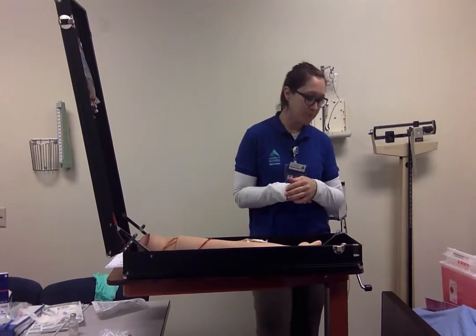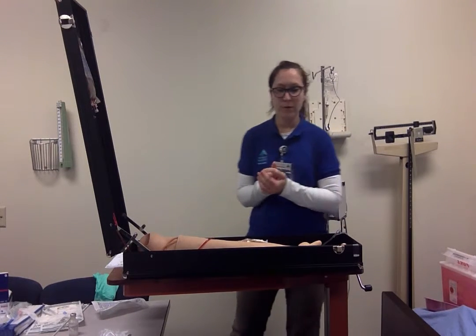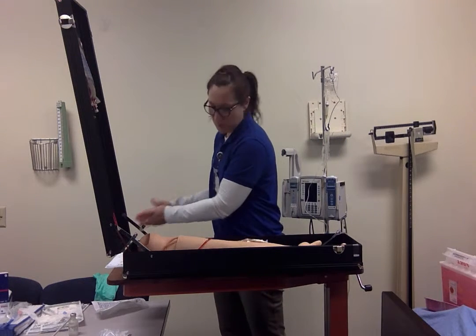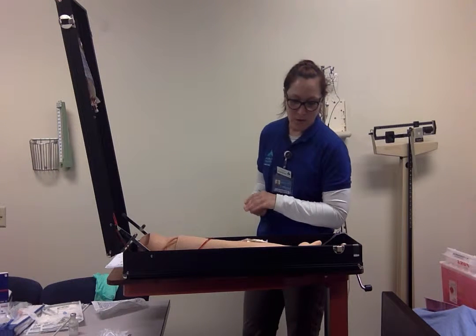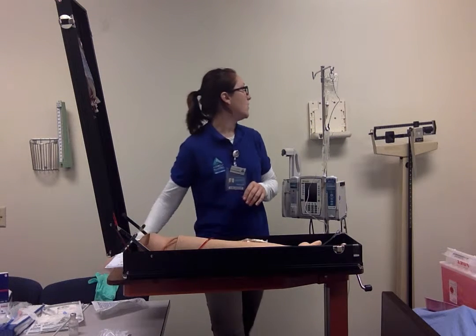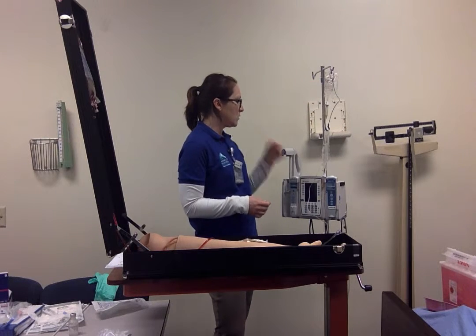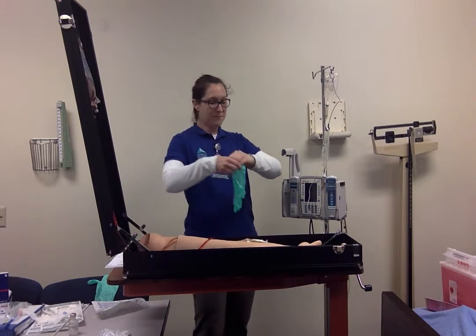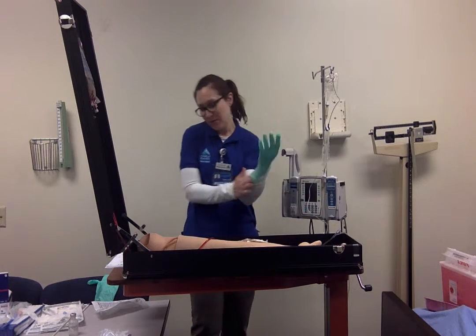So I leave the room, wash my hands, get rid of gloves, leave the room. I come back in 30 to 45 minutes, check to see how things are doing. I'm going to go ahead and wash my hands again. And just assessing, I don't see any redness, I don't see any infiltration, everything looks good. I noticed that the piggyback is done running, so I can go ahead and disconnect that and rehook up the primary. So I need to put gloves on one more time. I've already washed my hands, putting clean but very small gloves on.